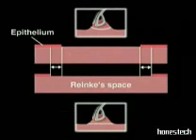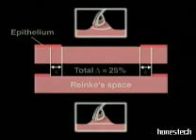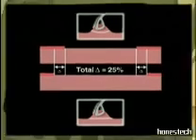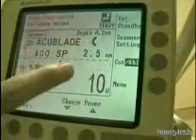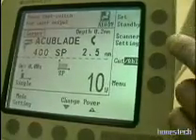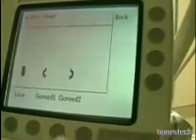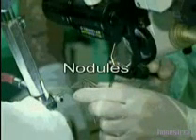A straight line incision would require an exceedingly extensive resection of these adjacent tissues and would needlessly expose Reinke's space and the vocal ligament. The AcuBlade control panel is sufficiently user-friendly to allow quick intraoperative parameter modifications if required. We shall illustrate the AcuBlade application with some surgical examples.